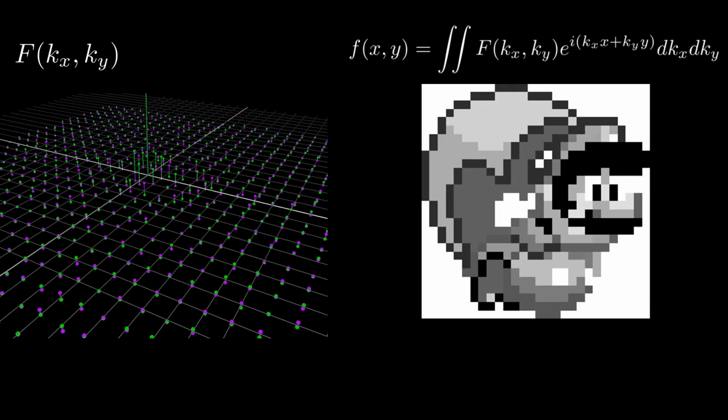First, the frequencies near the center of kSpace seem to have larger phasors than those near the edge. In fact, the very center frequency at kx equals 0, ky equals 0 is off the chart here. This frequency in particular is the DC offset, and for images is generally orders of magnitude higher than most of the other frequencies. Since pixel values of images are all higher than 0, the entire image rests at an average pixel value much greater than 0.